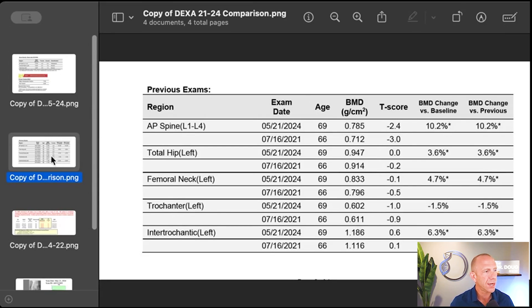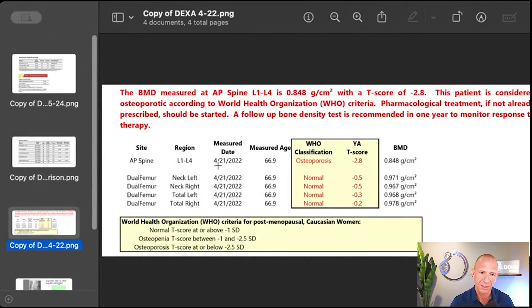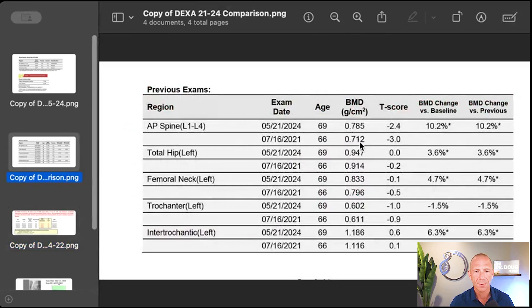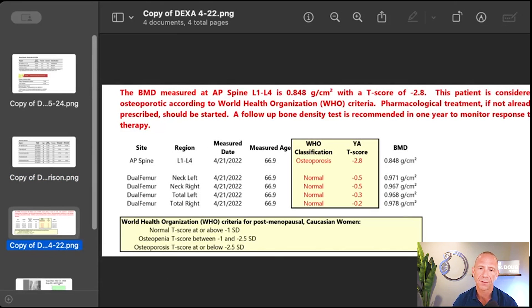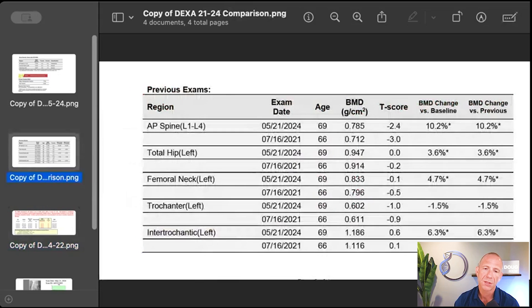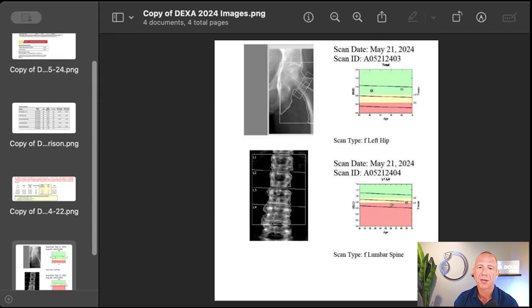However, she also had a DEXA done at a different center in between. Looking at L1–L4 BMD in grams per centimeter squared: on the original machine it was 0.712, then 0.785. The other center showed 0.848 — that doesn't fit. This is why it's critical to get repeat DEXAs on the same machine, preferably with the same operator. The T-score difference between machines was small — negative 3.0 to negative 2.8 — so you can't claim significant change. When calculating improvement, always use bone mineral density, not T-score, to get the full picture.